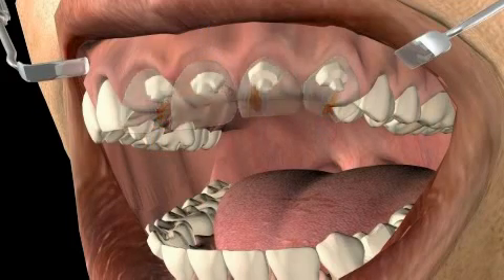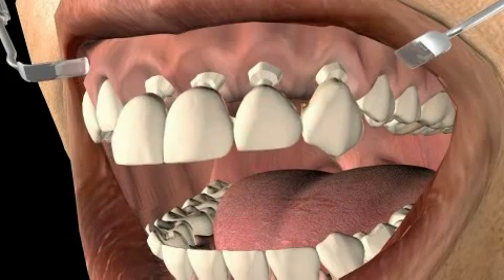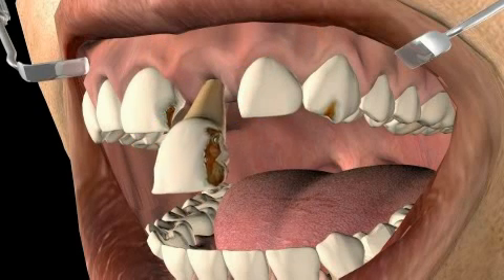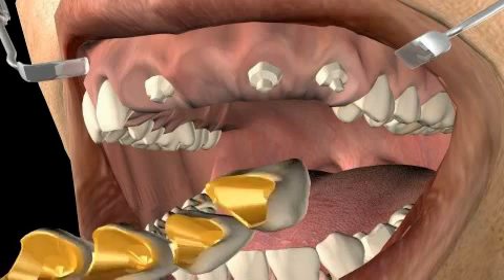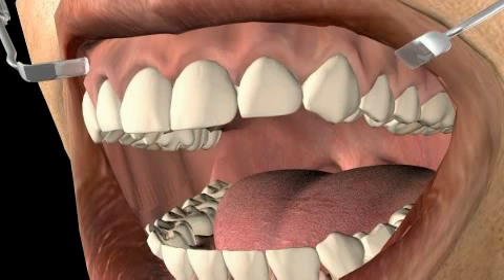Blocking individual teeth, such as in cases where there's no gap in the teeth, is not necessary. The dental technician and the dentist are spared work by blocking the crowns, but that presents disadvantages for you, the patient. So blocking of teeth realistically only makes sense in those cases where teeth happen to be missing, namely to bridge the gap in the teeth with a link.